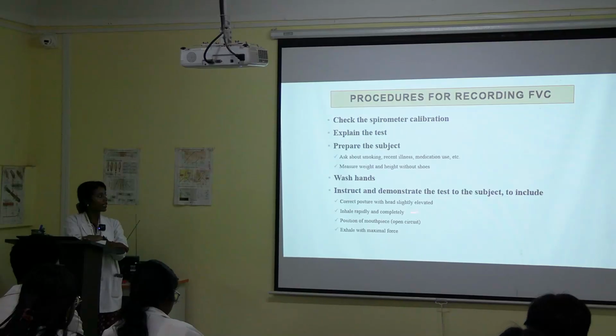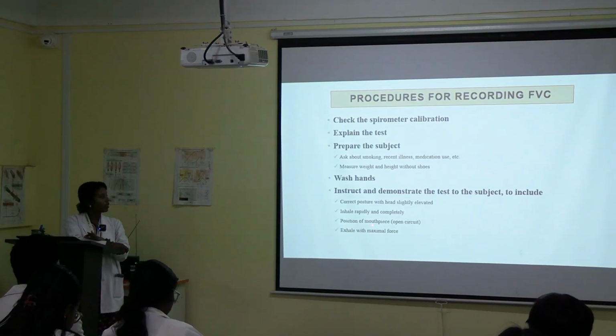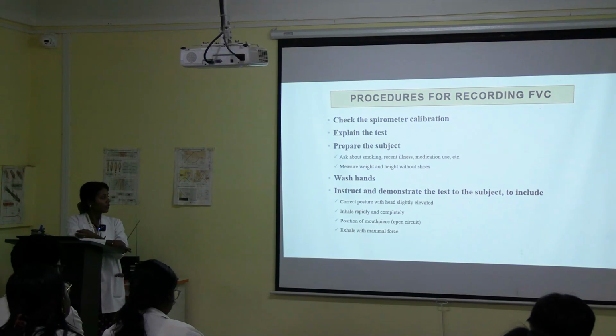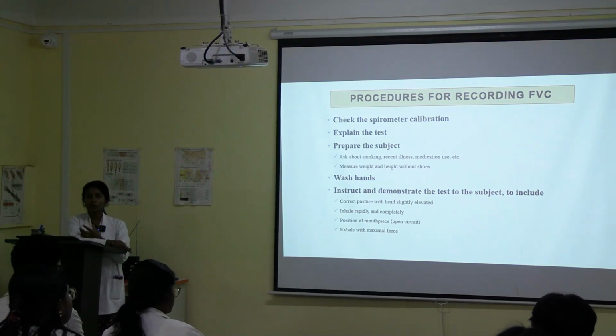Then the head slightly elevated. Then inhale rapidly and completely. Then the position of the mouthpiece has to hold correctly so that there is no air leakage from the mouthpiece. Then he has to exhale maximally with force.